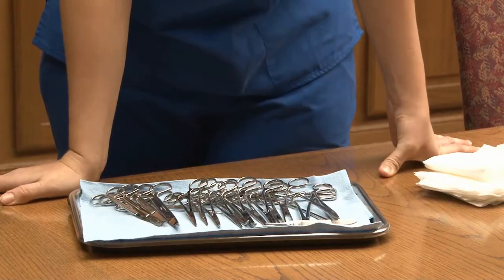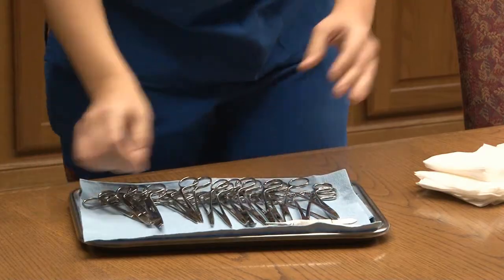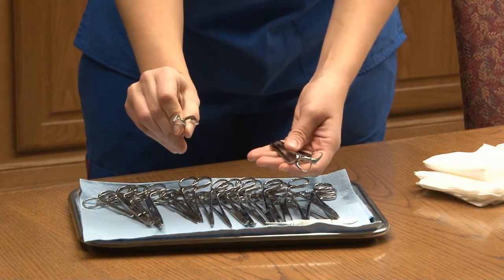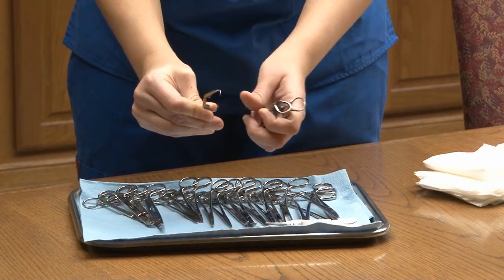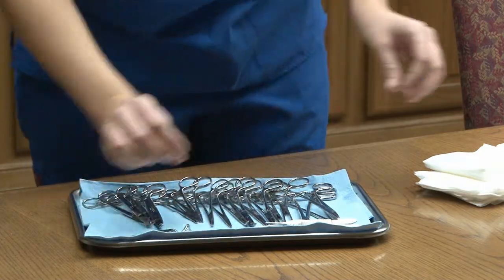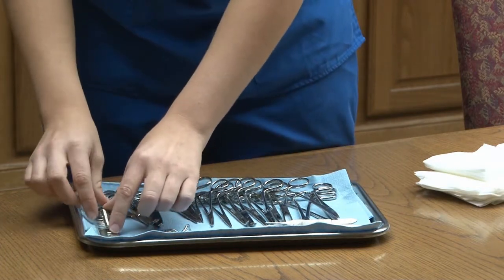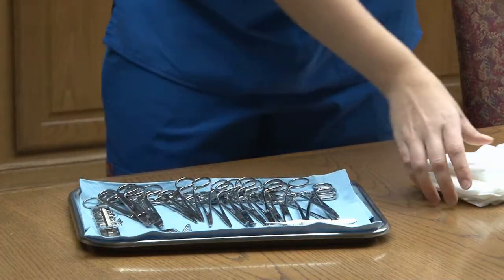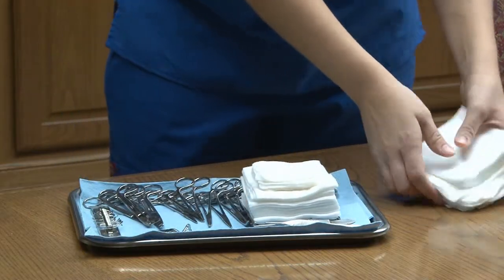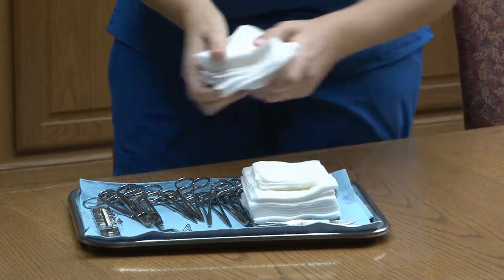If I had a spay hook, I would use it — since it's longer — to loop through these instruments. Next, I'm going to place my towel clamps. These are the instruments with the sharp little hooks, and I'm going to take them and neatly place them in the other corner of the tray. Next, I'm going to take my needles and put them in a space so they all fit nicely, then collect my sponges or gauze pieces and arrange them.